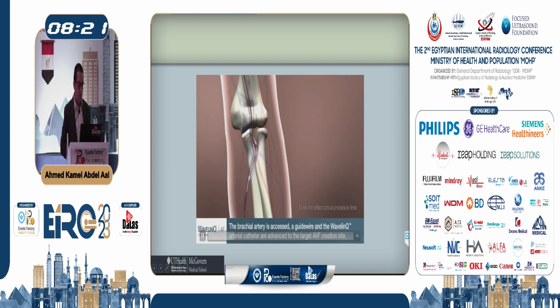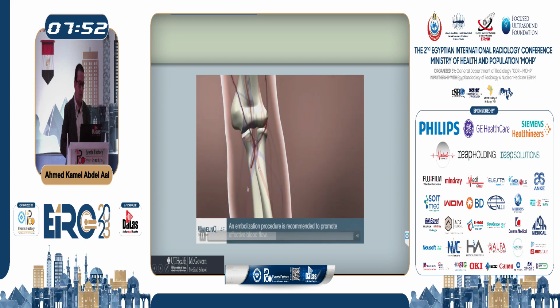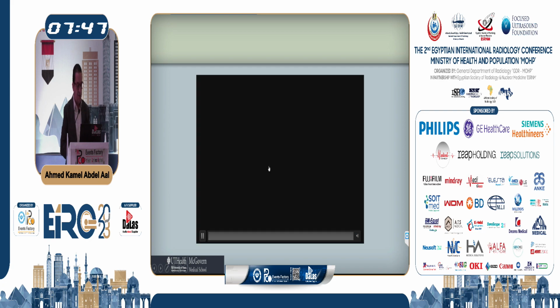This is how you pass a catheter into the artery and another catheter into the vein. And these sets of magnets here will help place these two catheters side by side. As you can see, it approximates them. These are magnets, and these two are very, very close to each other. You pull the wires back, and then you activate the device. That creates a hole here between the artery and the vein. And now you remove both catheters, and then the blood flows through that hole from the artery to the vein, and then through the perforator into both the cephalic and basilic veins.